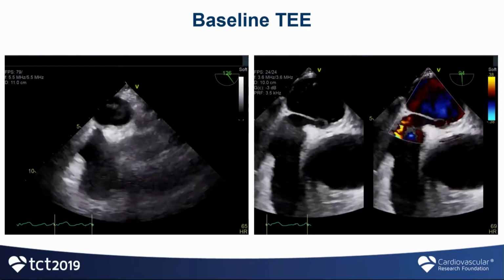Yeah. So John, why don't you highlight what the complexities are anatomically in this particular case? I think some of the things that you mentioned already have to be distinguished up there. You have more than one entity. You've got a little bit of a thickening of the secundum. You clearly have a tunnel that overlaps, although there's a big gap in there. You've got Doppler flow that's pretty much continuous throughout the cardiac cycle. And even in the early trials, before they were all positive, the one subset that was positive were the people who had atrial septal aneurysms and had a large shunt.